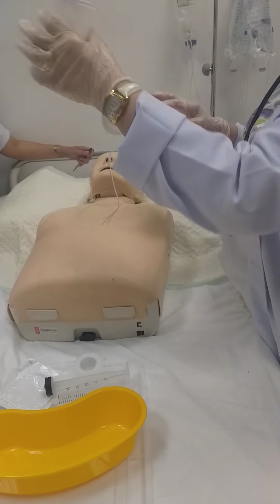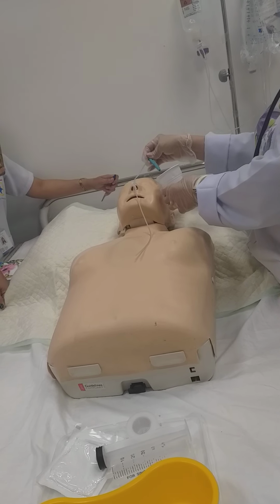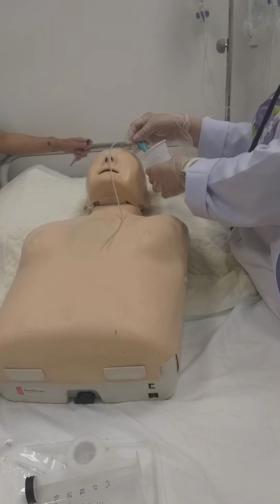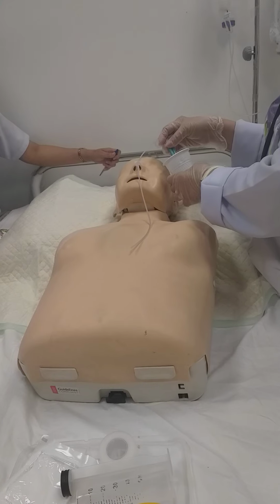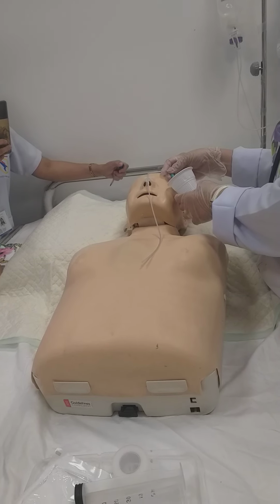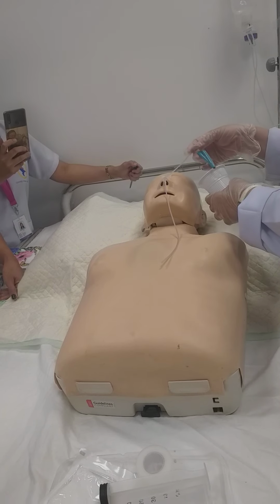Third test. Get your water, a glass of water. Soak this. Open and pinch and open. Soak. So you will find bubbles. Once you find bubbles, it means to say it is out. It is not inside of the tummy. It's not inside of the stomach. So, where is it coming from? The bubbles come from the lungs, okay? Because there is air. So, it is not in. Redo. Go back to one.